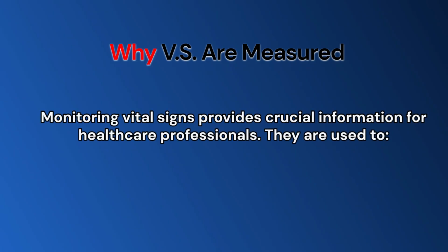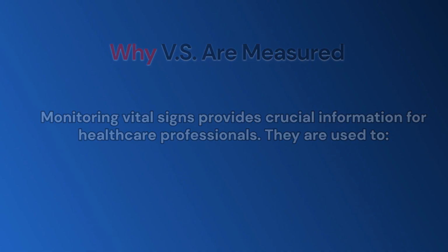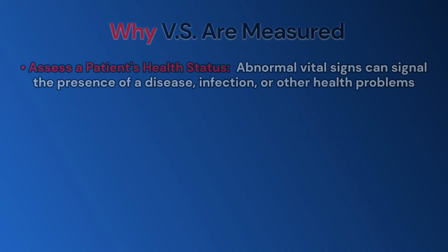Why vital signs are measured. Monitoring vital signs provides crucial information for healthcare professionals. They are used to assess a patient's health status. Abnormal vital signs can signal the presence of a disease, infection, or other health problems.